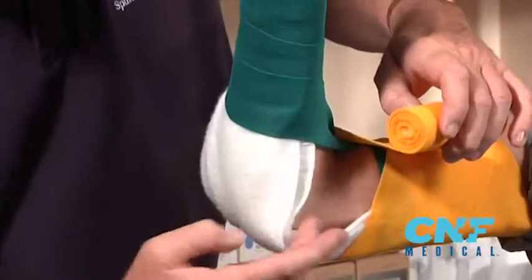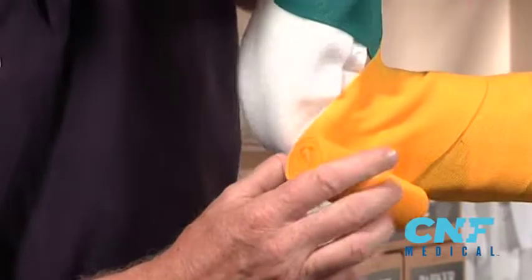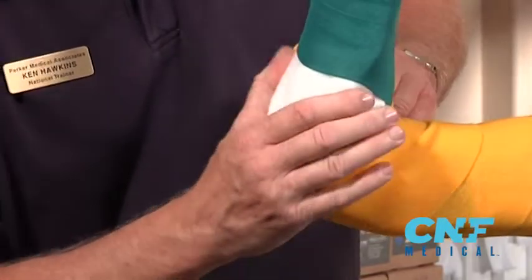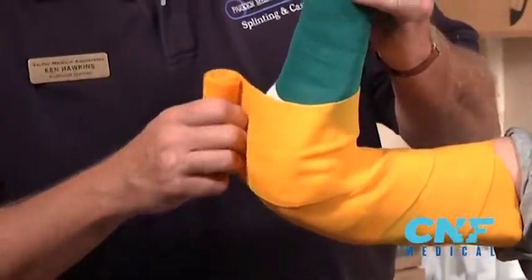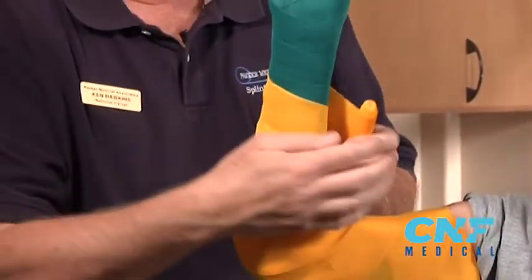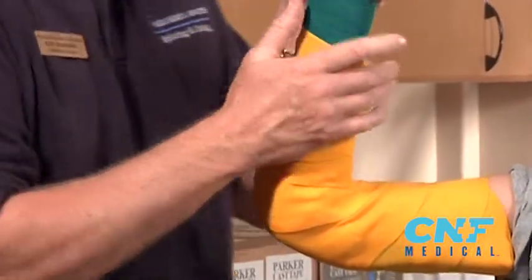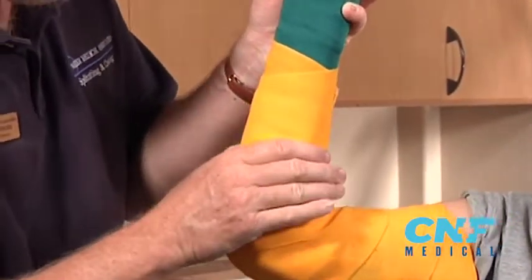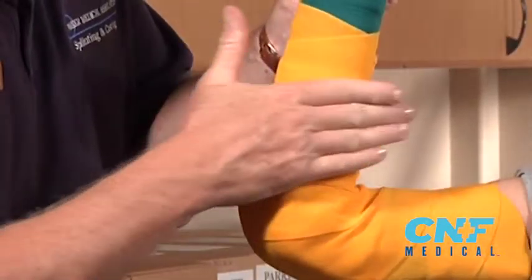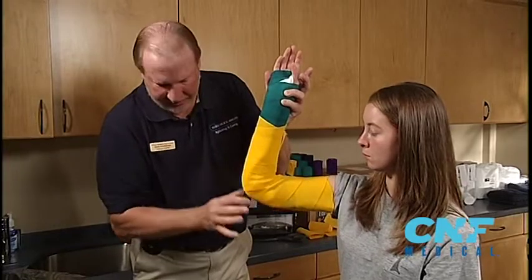You'll notice here — this is only padding, no fiberglass at all — nicely rounded around the elbow. This also gives 14 layers at the stress point. Nothing digging into the patient. Just close it down. Palm your hands, smooth it out. MCPs are free, the thumb is free, 14 layers at the stress point.